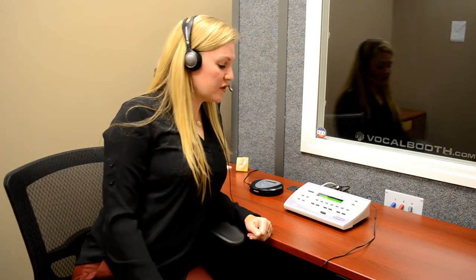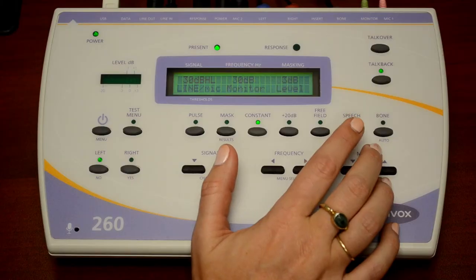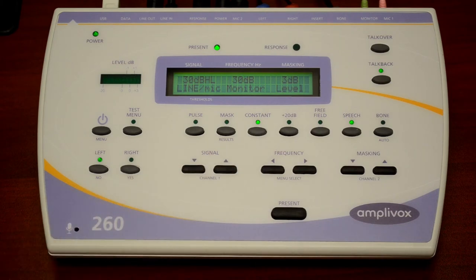If you have a CD player, the way that you would do it is for speech, you would press the button again and you would see the screen line dash mic monitor and level. That's when you know that you're ready to use your CD player, which is the suggested way of being able to do it. Recorded speech is always going to be better than your own voice.